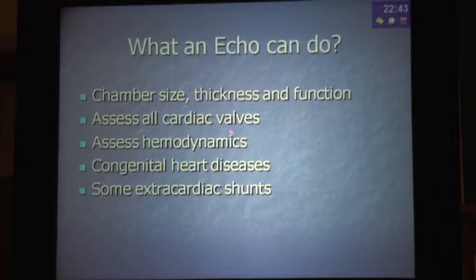Assess our cardiac valves, pick up mitral stenosis, mitral regurgitation, aortic stenosis, aortic regurgitation, and likewise. Hemodynamics, if a patient comes to you with acute pulmonary edema, even with normal LV function, patients can go into heart failure. So we look at PA pressures, right ventricular filling pressures. What our JVP used to give us, or still gives us in clinical practice, our echo helps us even further.